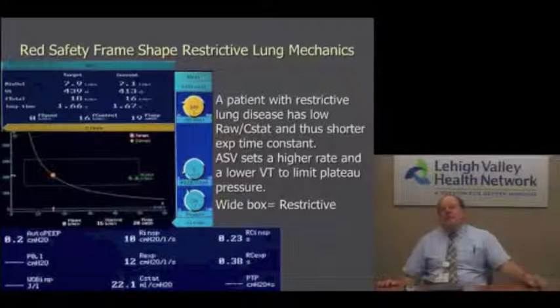The other nice feature about this is if the patient takes 2 spontaneous breaths, it will transition from full ventilatory support to partial to spontaneous, and the patient will be on spontaneous breathing, and the pressure support will go up and down to give the target tidal volume. So if it's targeted at 440 cc's, it might give pressure support of 10 one breath, 12 the next breath, 8 the next breath to guarantee the patient gets that tidal volume.